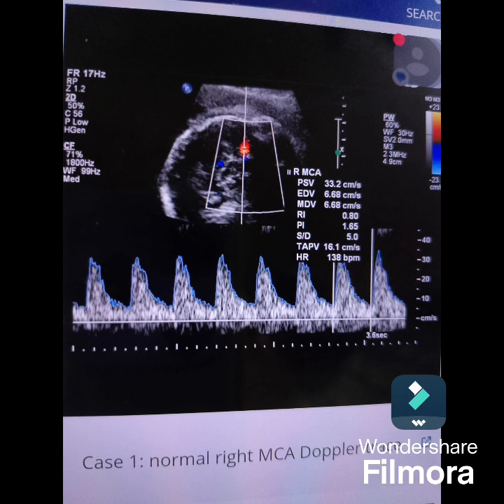Now when do you deliver before 32 weeks, at 30 weeks? When abnormal ductus venosus waveforms are present, reverse A wave in the ductus venosus, the cardiac function is also affected. So even before 32 weeks, at 30 weeks, it has to be delivered, because once the ductus venosus abnormality appears, it is a matter of hours for fetal survival. So this is the flow chart for IUGR depending upon the umbilical Doppler.